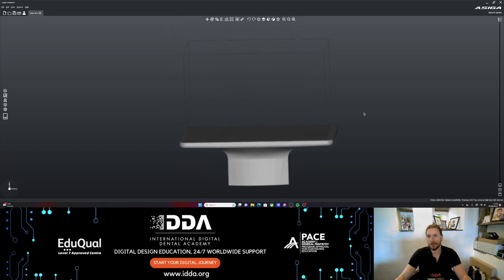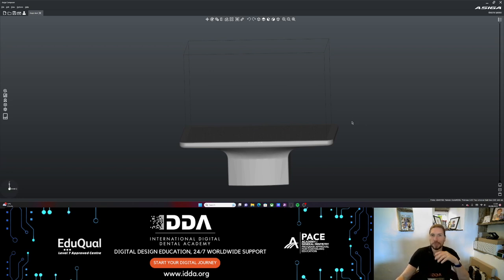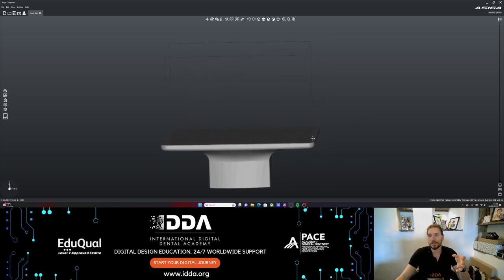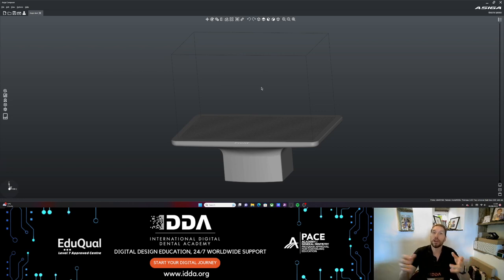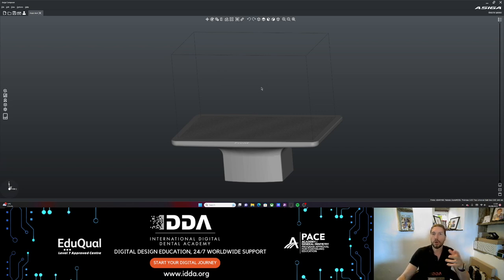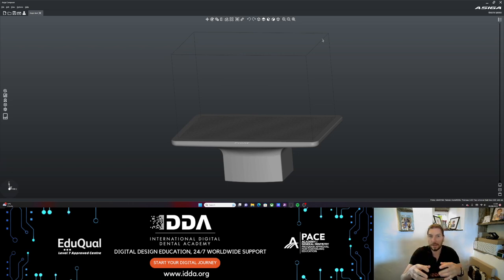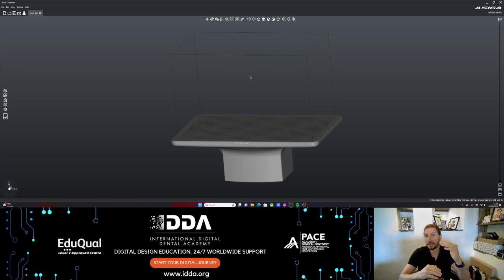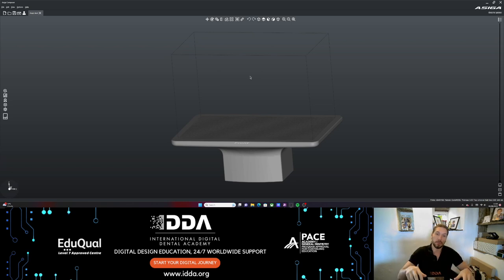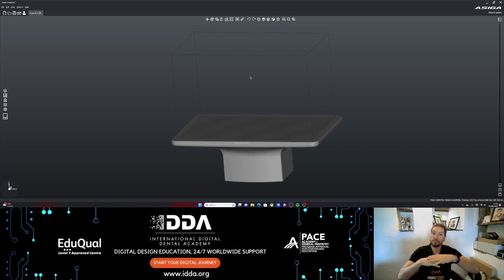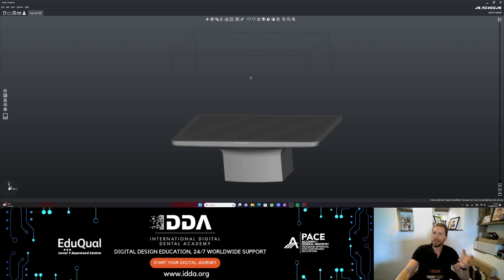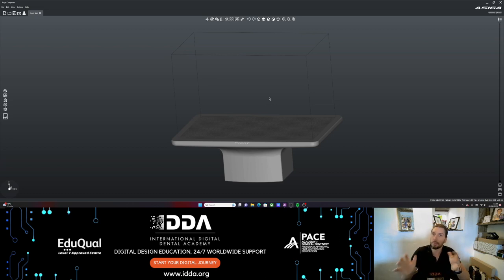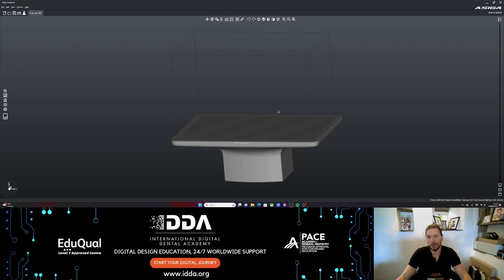If you're new to printing and looking at this software for the first time, this box you can see here shows us the boundaries of what we're able to print within on this build platform. You're not only seeing the build platform here but the entire volume of what's possible to fit in there. Asiga are well known for their ability to create stacks, to print multiple models. We can print a couple of models, add a stacking shelf, and then print another model. Print a few at a time and then dismantle them at the end, rather than two on a platform, print, take them off, two on a platform and so on. That really comes in a big way in the bigger Asiga printers where you've got a lot bigger print platform.